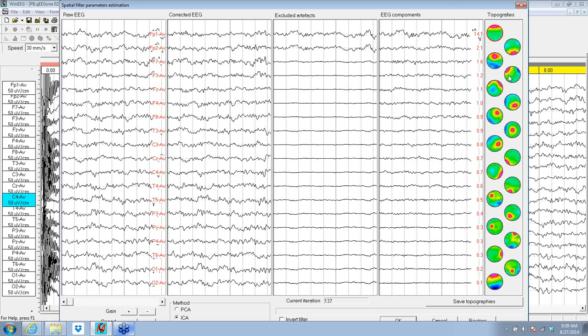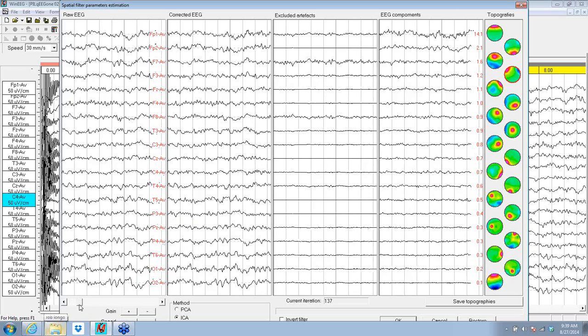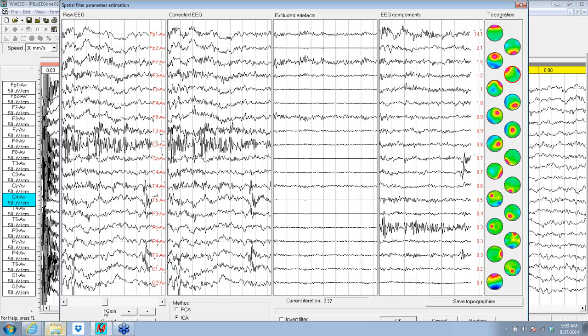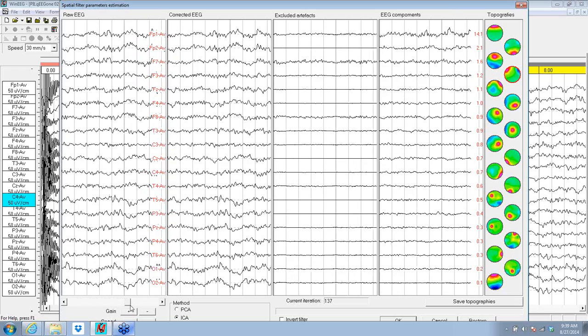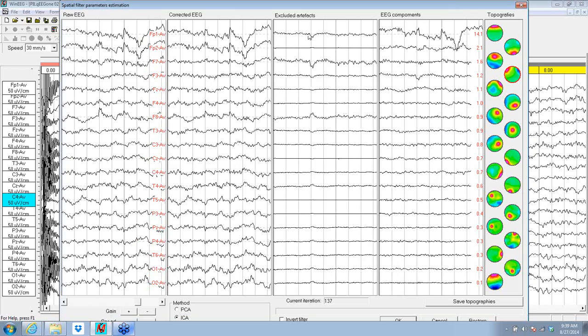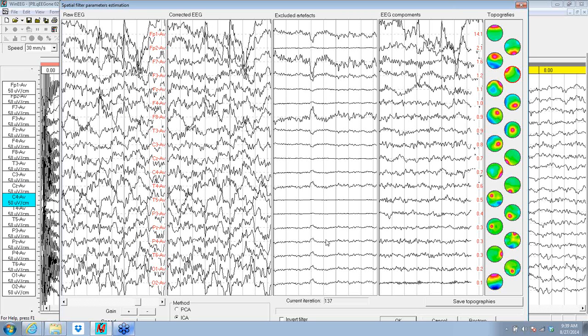Lateral eye movements here. We had a fair amount of lateral eye movement within the EEG, so I'm going to click on that as well. I'm going to turn off the eye blink and actually scroll through. We'll see that there's times when the F7, F8 divergence ends up being a little greater, where there's actually a little bit more of a lateral nature to the eye movement. Here, for instance, is an eye movement that's largely lateral, F7, F8. We turn this up, you can see it's actually T3, T4, and it's got content all the way to the back of the head. So it's slightly lateralized, and it's a lateral eye movement.